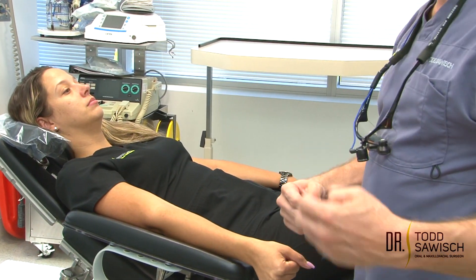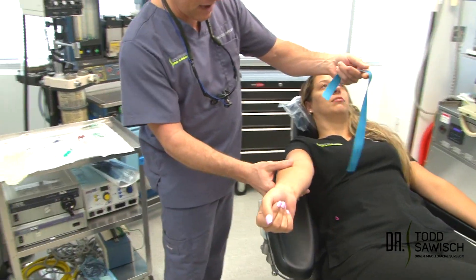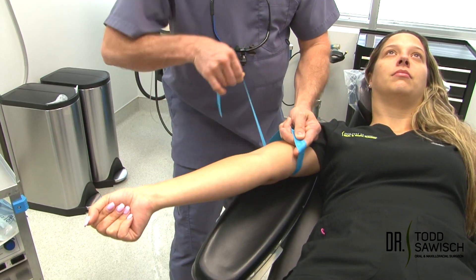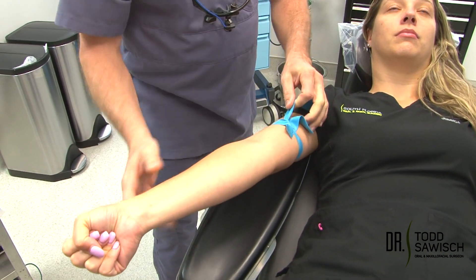The next thing we're going to do is put on a tourniquet. The tourniquet is applied by having the patient lift their arm, drop the tourniquet on the inside, grab it from underneath, pull, loop over, pinch, and wrap this underneath just like so.